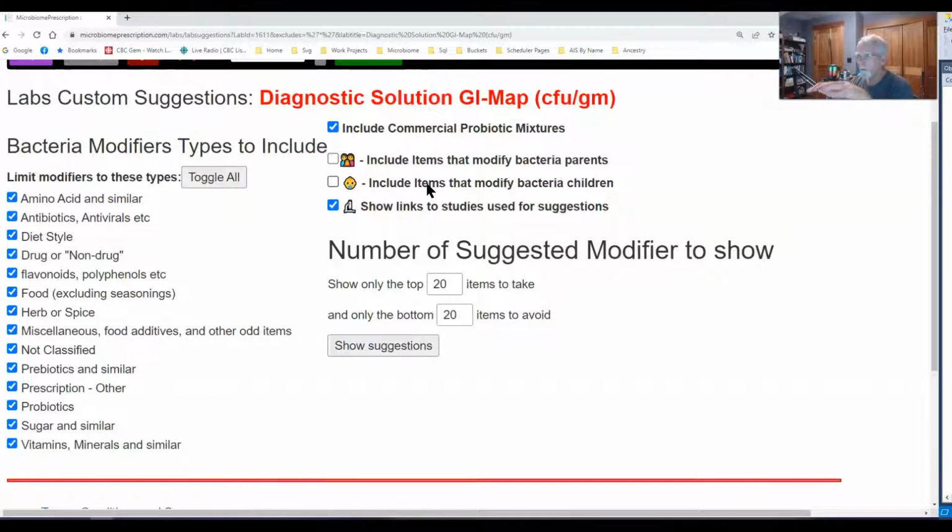And it goes the opposite way, as in you may have no information about the country, but you have information about certain neighborhoods, and can't we just aggregate it all together? So this is basically what happens. We are taking studies which aren't exact matches and saying, okay, let's apply the information with reduced significance to the next layer of government hierarchy up, or down, or particularly bacteria taxonomy up or bacteria taxonomy down.